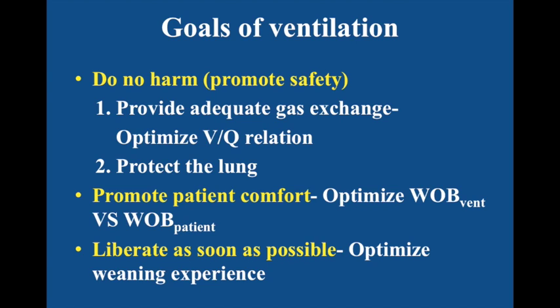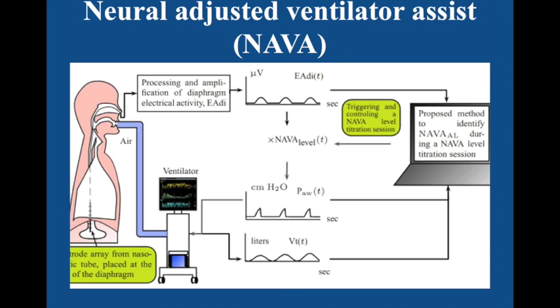NAVA is a new mode of mechanical ventilation that uses the electrical activity of the diaphragm, which we call EDI, to control the ventilator. So this is NAVA.